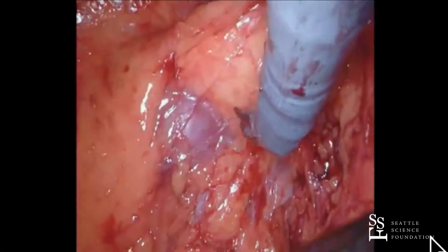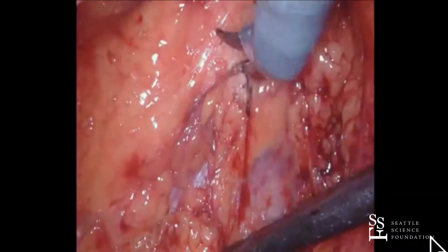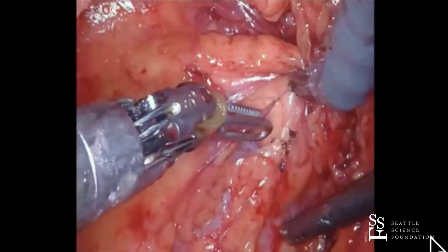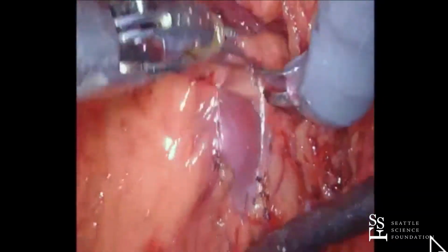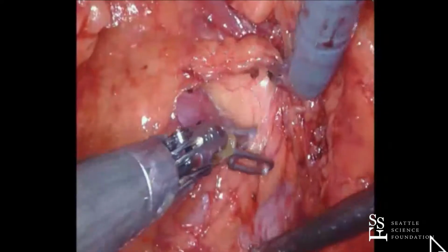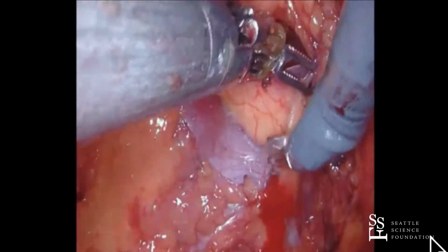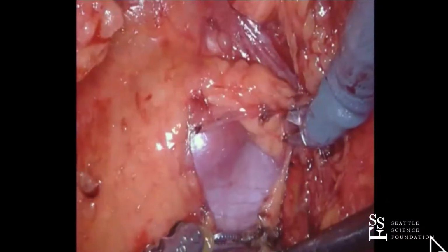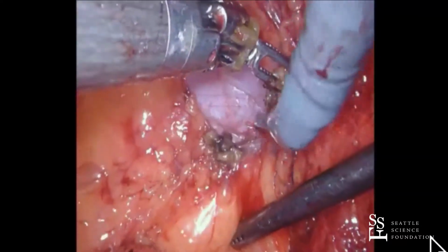Oh, so Jim, a question from the audience. Any comments on the BK or the Aloka? Are you using a BK here, and do you have a preference between the two? BK, yeah. I think they're both nice. I like the BK because I like the fin at the tip. I think what you get is a better contact, and I'll show that when we get in. When you have the fin being held by the tip of the ProGrasp, and then you also have the back of the ProGrasp pushing down on the back of the probe, I think you just get a better contact. So that's why I like that one.